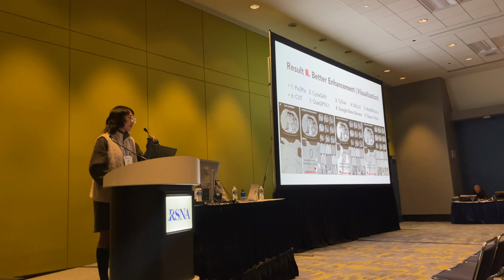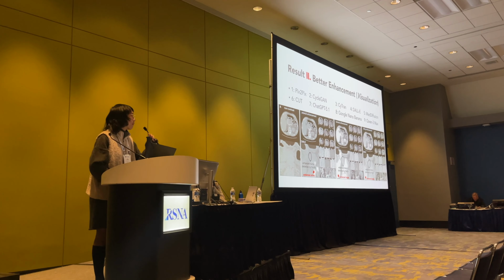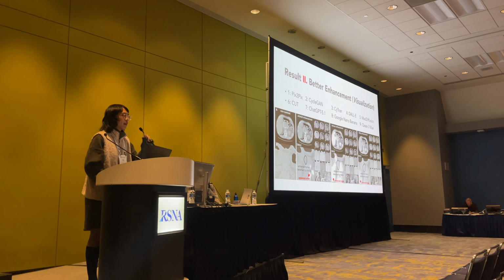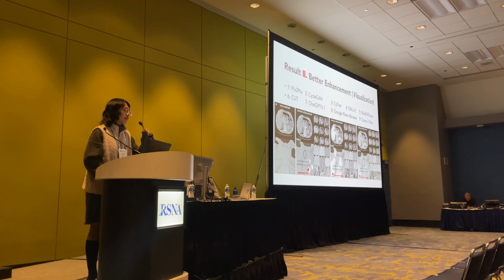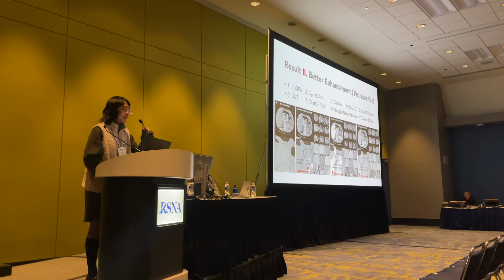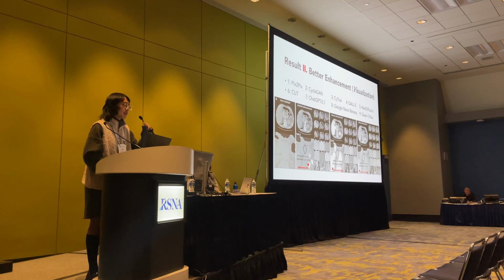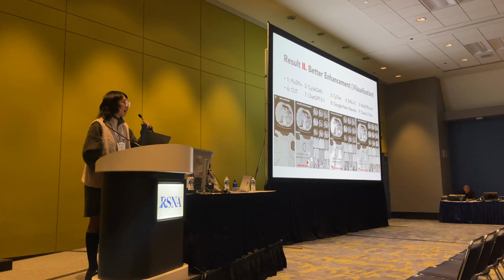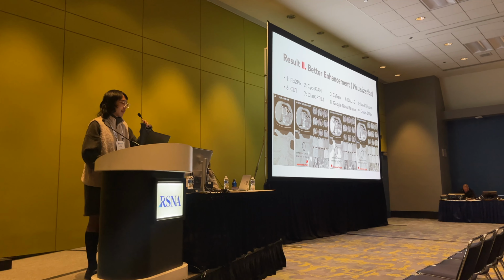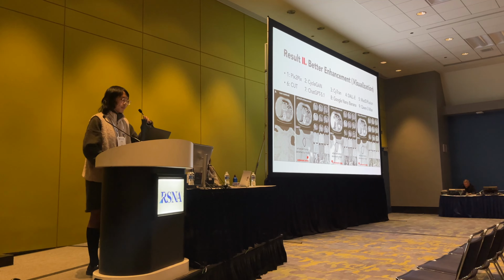For the second one, we also add a visualization comparison. This plot shows our method compared with 9 baselines, which are hybrid, commercialized, and specialized. The first row is the image quality, and the second one is the zoom-in area for the pancreatic tumor PDAC detection results by a tumor detector. On the left side, you can see that for the non-contrast, the detector fails to detect the PDAC, but after the enhancement of SMILE, it is successfully detected, marked in the circled area.